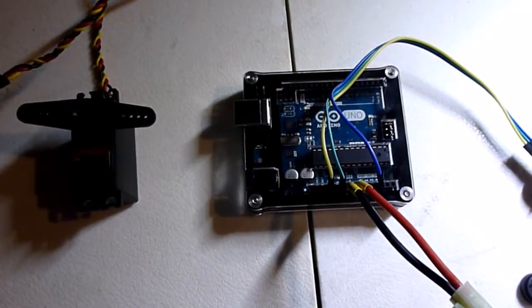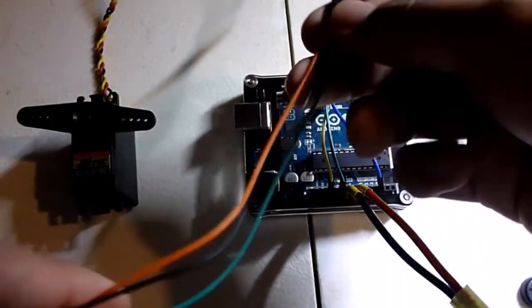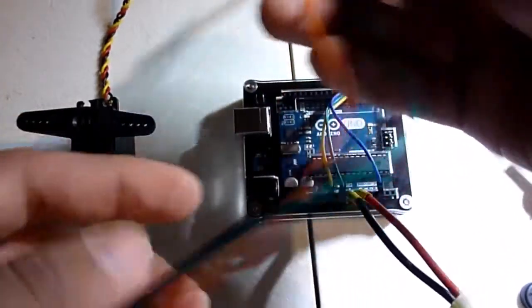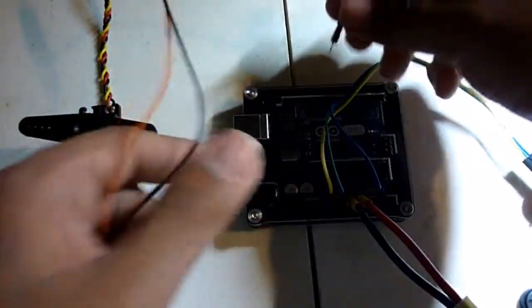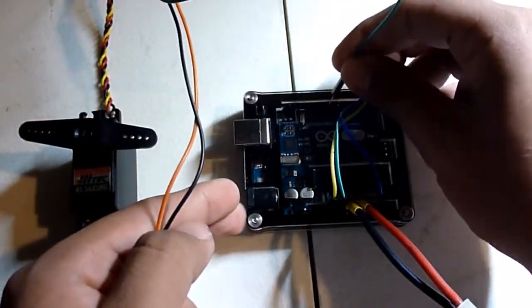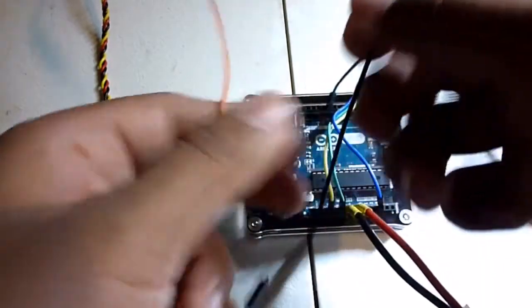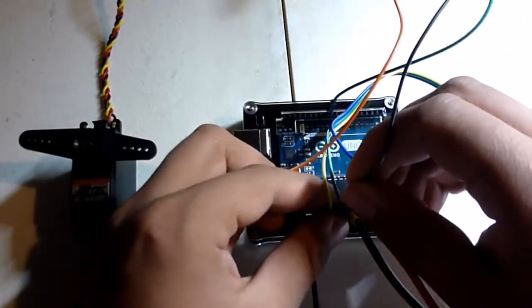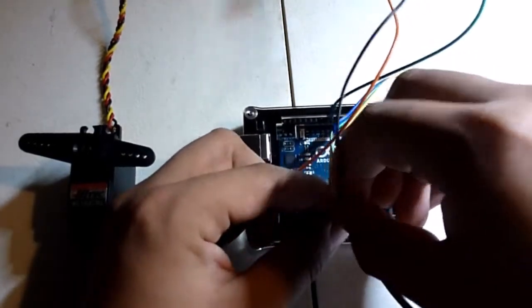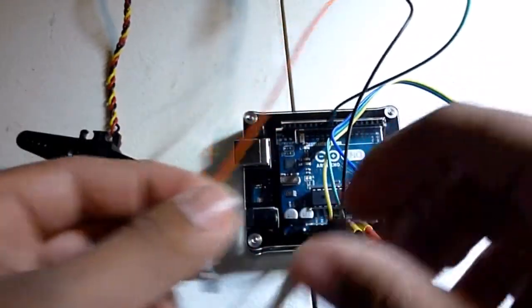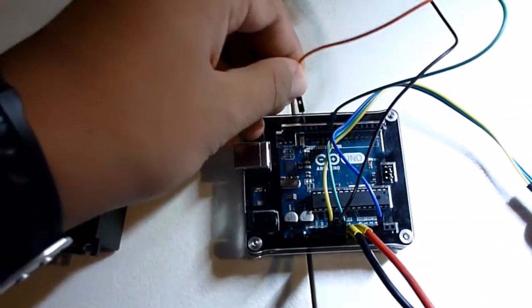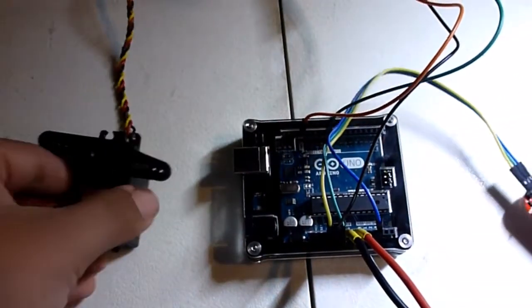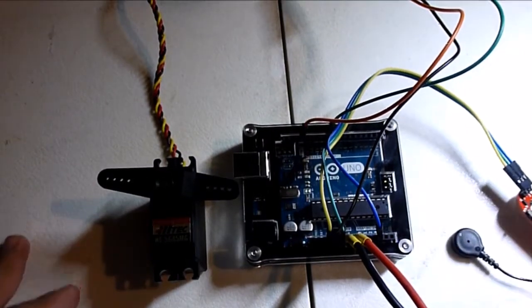Here, I have my servo, and attached to it are three male-to-male jumper wires. So first, I'm going to get the signal and attach it to pin 9. I'm going to get the positive lead and attach it to the 5V output. And then, I'm going to get my negative lead and attach it to the ground. This is all you need to make this circuit work.